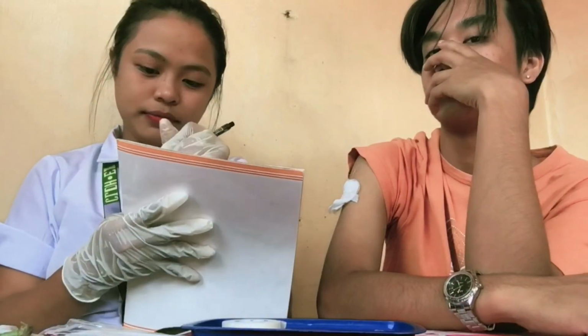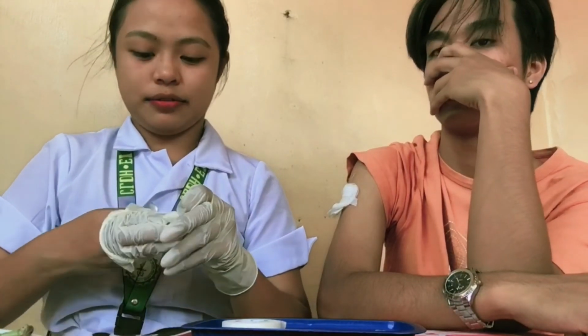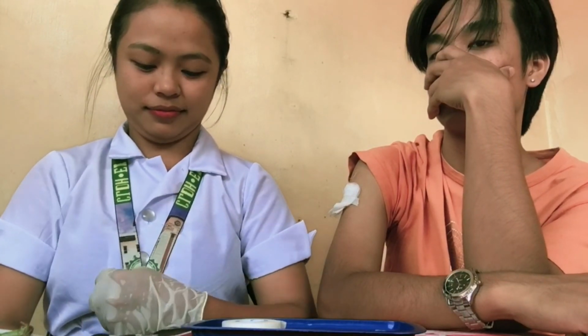Next, we need to write in our medication record the time, date, and the medication that we gave. After that, we need to dispose of all the things that we used in their right disposal. Then we remove our gloves and dispose of them in the right disposal. After that, perform hand hygiene.